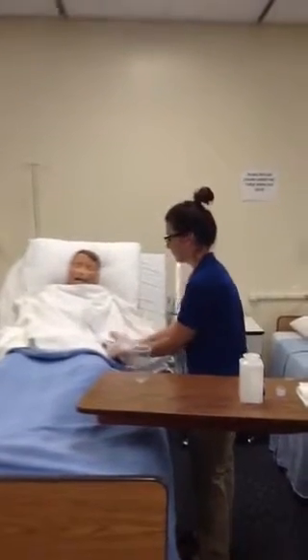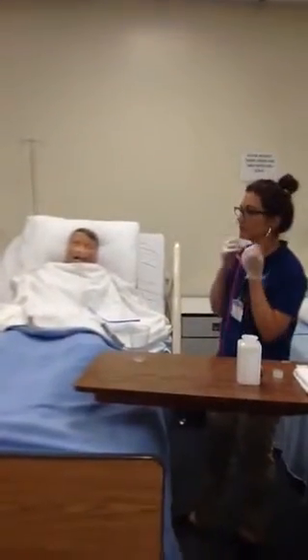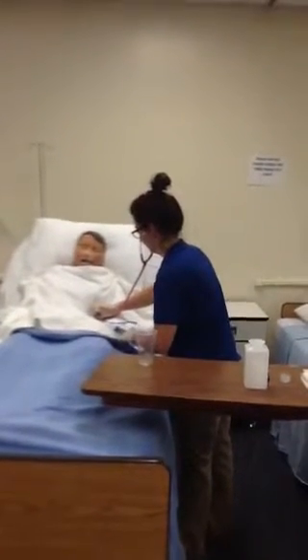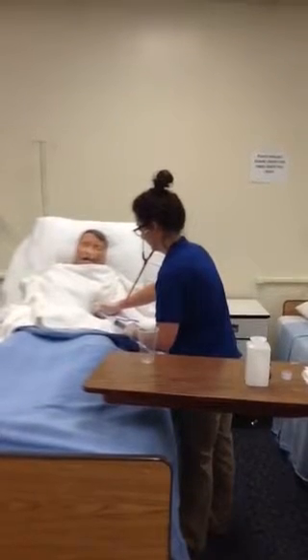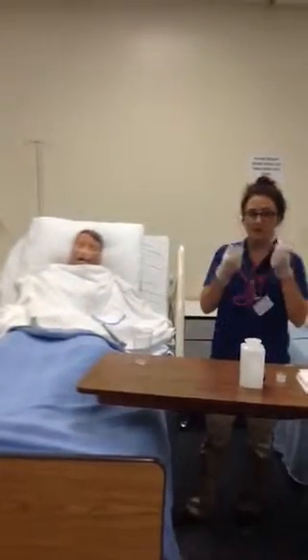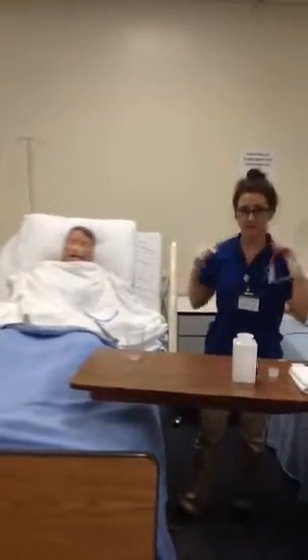Alright, so I have pulled 30 milliliters of secretions. Now I'm going to listen for placement. Okay, so I have verified placement. I did hear the contents go back into the stomach.